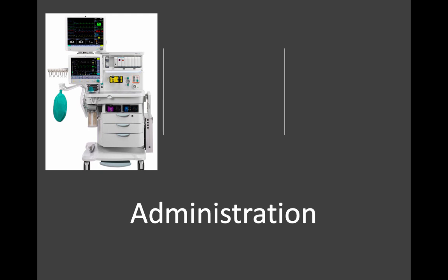These are very big machines, and it can be a challenge to move them to the ICU. They do need a level of comfort and expertise to run. Also, the ventilators themselves that are used in the operating room may not be as powerful as the ventilators that we use in the ICU. They're really ventilators that are built to ventilate patients in the short run for an operating time of hours, maybe a day, whereas in the ICU, we're typically ventilating ARDS patients for much longer than a day.